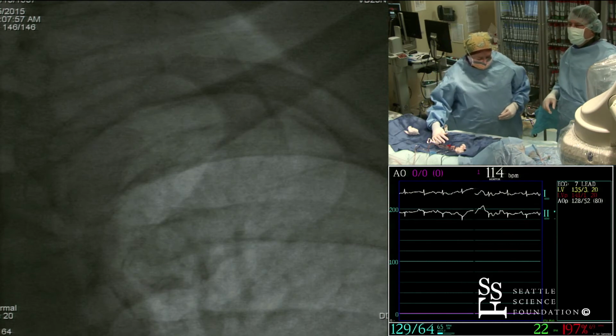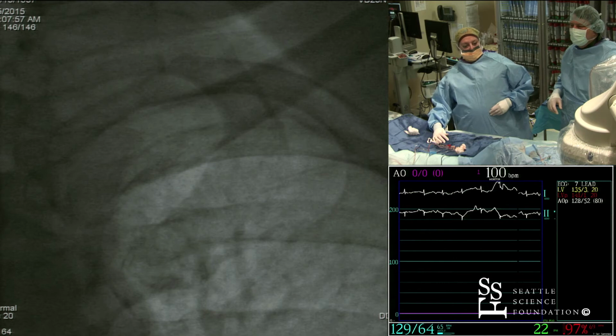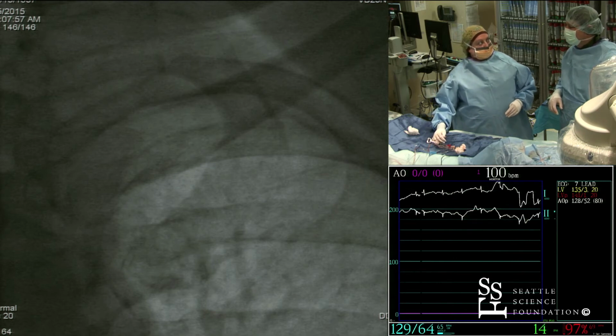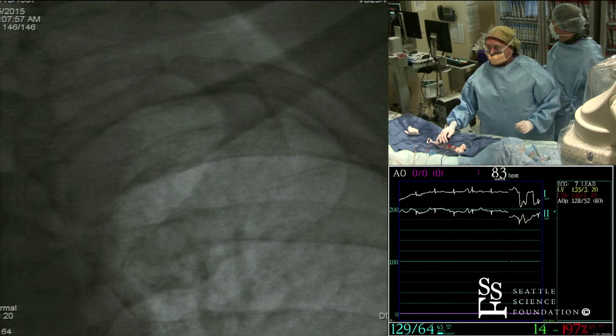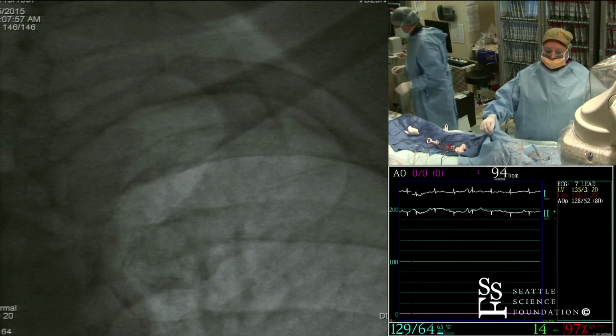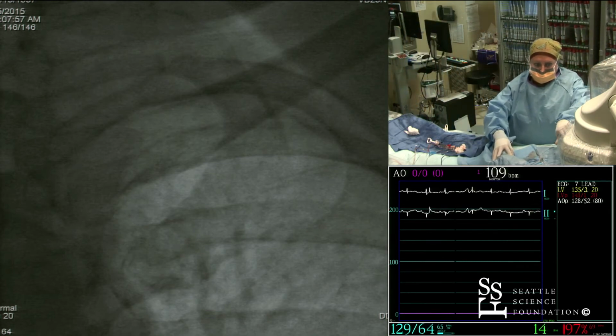Do we have a pulse ox that's set up in here? Let's do, how hard would it be to do that? Okay, we'll just move it. Let's move it over. Can we bring the pulse ox up on the screen? We'll just show you the Barbeau test just so you can see it.